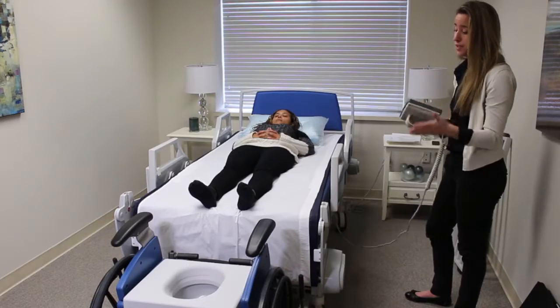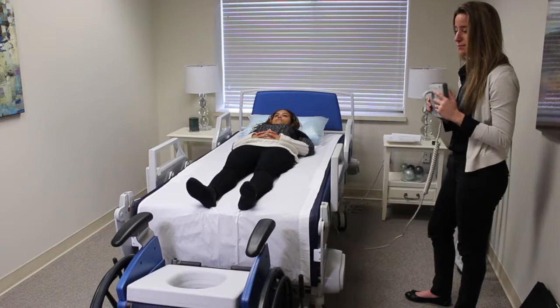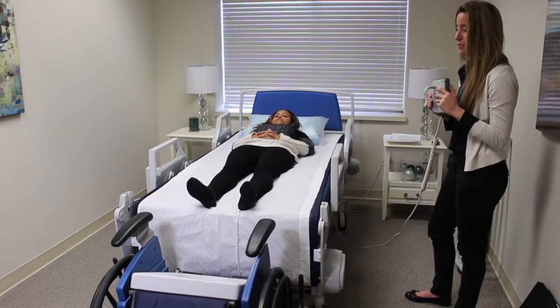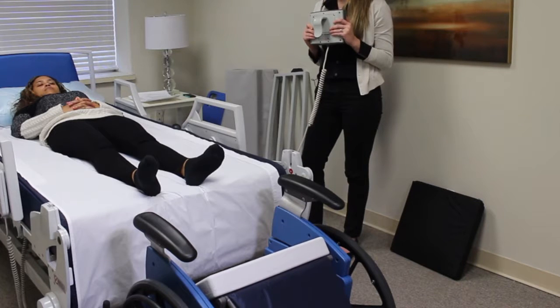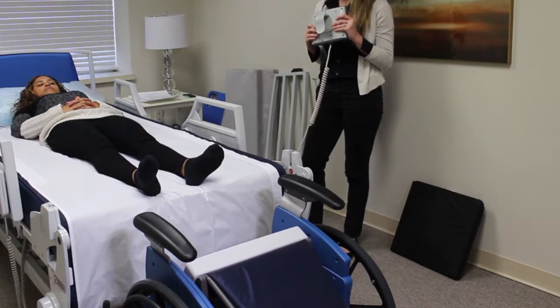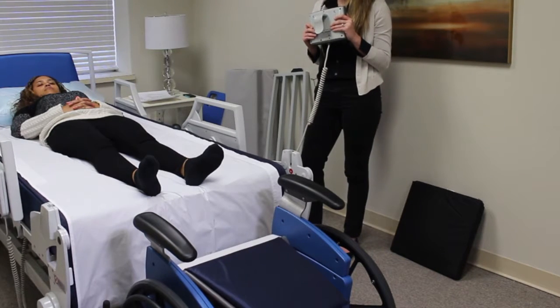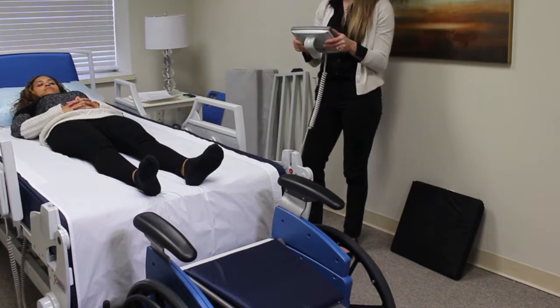Then you want to reattach the chair — you're already on the same screen. You press attach chair. You can see the chair is rotating back to its original position and it prompts you with done.